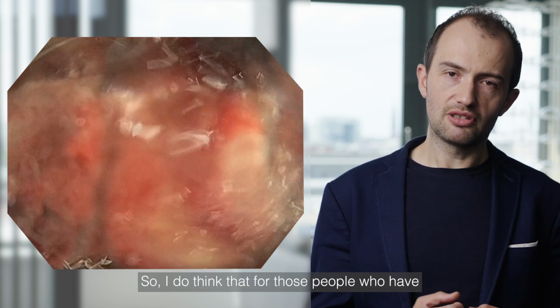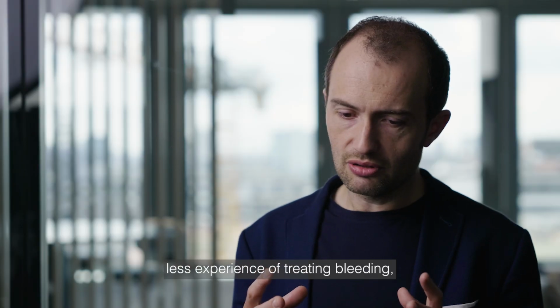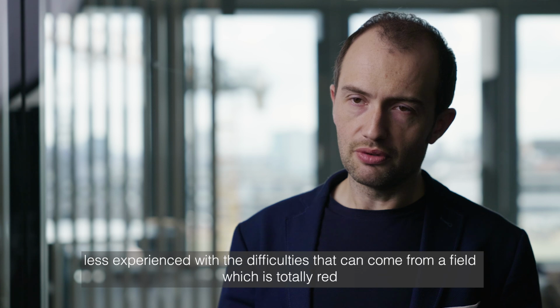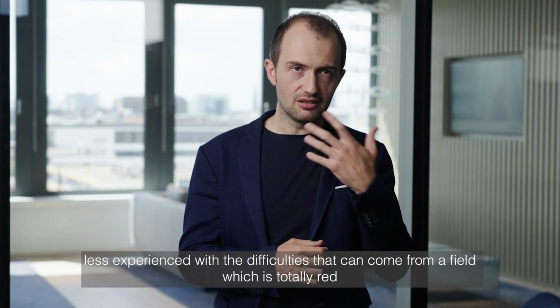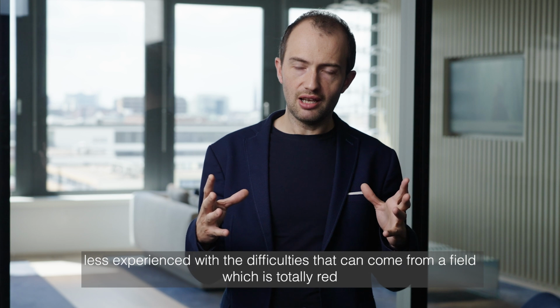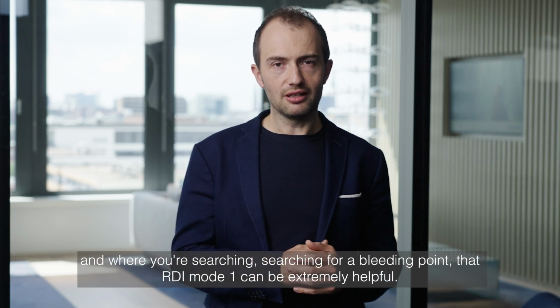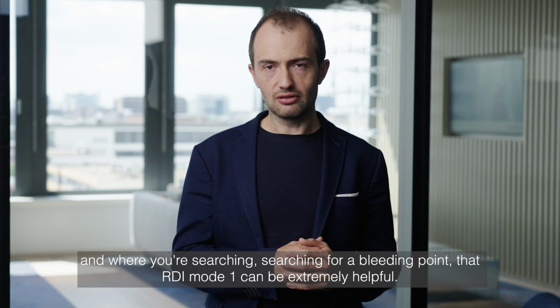And you can see that just with the red on the screen now, it's much more difficult to see that vessel. So I do think that for those people who have less experience with treating bleeding, less experience with the difficulties that can come from a field which is totally red and where you're searching for a bleeding point, that RDI mode 1 can be extremely helpful.